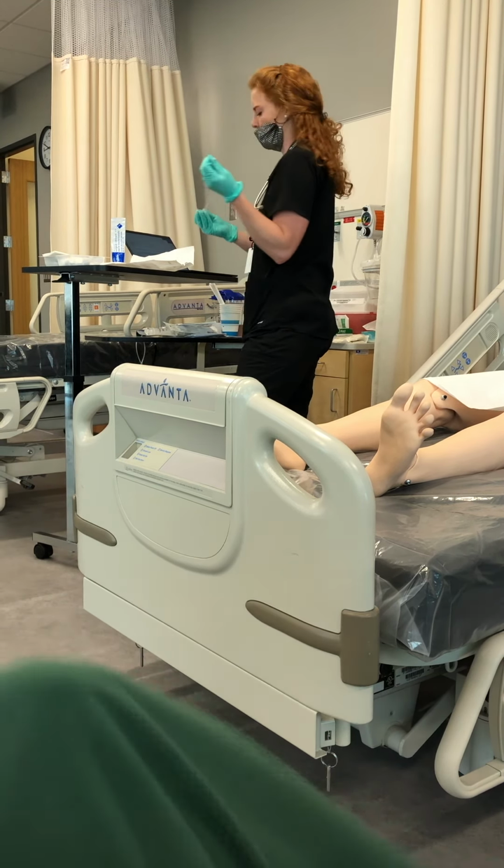So you open it up, pick up the suction catheter and wrap it around your dominant hand. I am right-handed, so I'm going to wrap it around like so. With that non-dominant hand, I am then going to pour sterile saline into the basin. This kit doesn't have a basin, and it doesn't even have any sterile saline, which is odd. We'll find some. But what you would do is use this actual tray as the basin because it's still sterile. So you can just pour that in there.